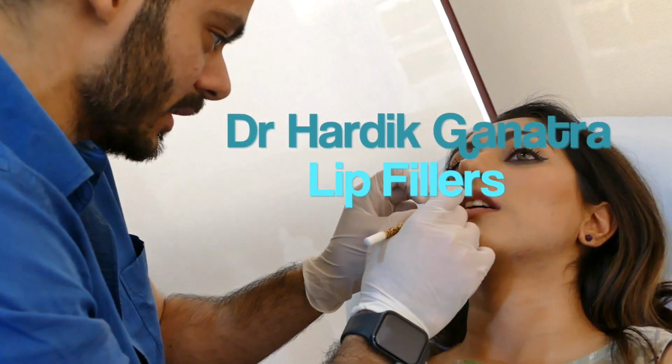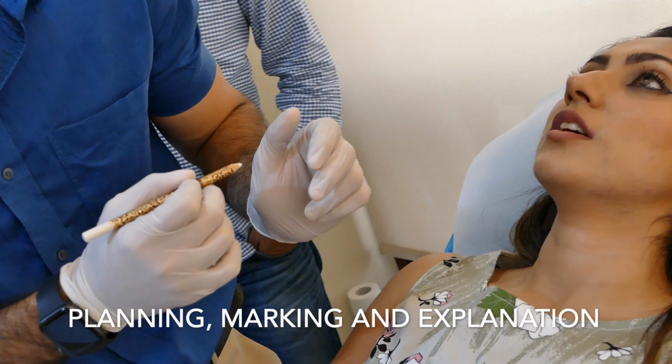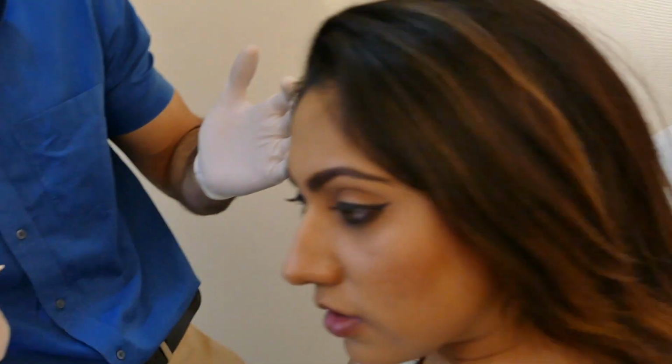This is filler lip for a patient with asymmetrical lip, and listen to the conversation Dr. Hardik has with the patient while he is performing. It has a little more volume than this side. You want to have a look? Sister, mirror please. You think this side has more volume? Yeah, okay, could you sit for me please?